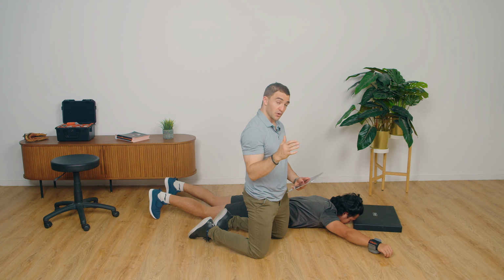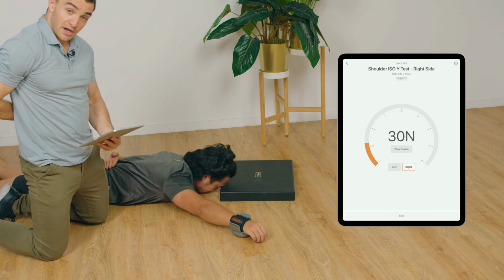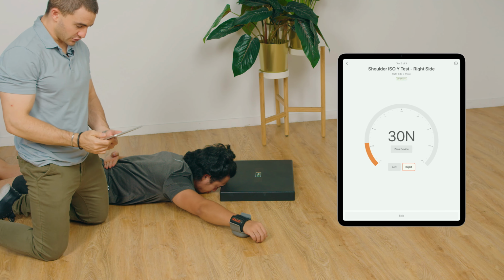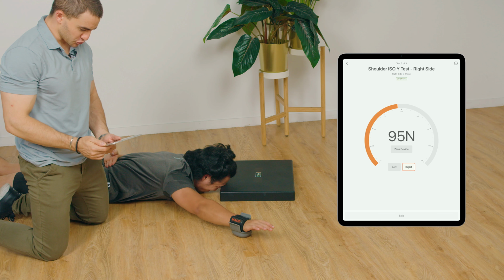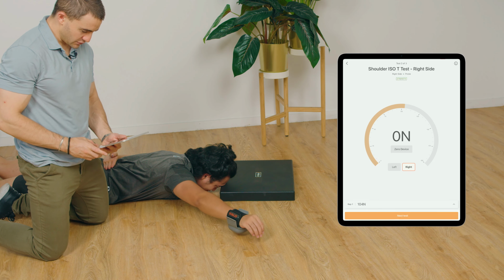I typically eyeball it, but we can use a goniometer if we want to be sure that Cal is in the appropriate Y position. Same thing, hand is behind his back on the other side now. And 3, 2, 1, go. Push, push, push, and relax. Go ahead and lift the arm up. Perfect. We'll move on to the next test.